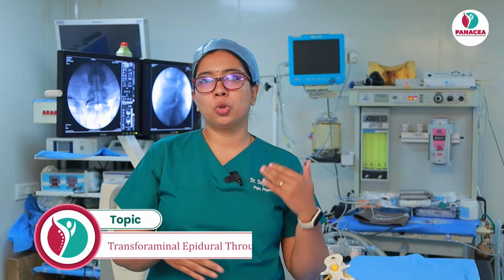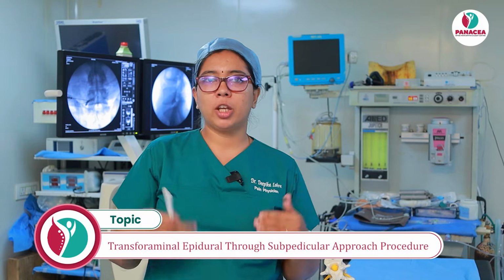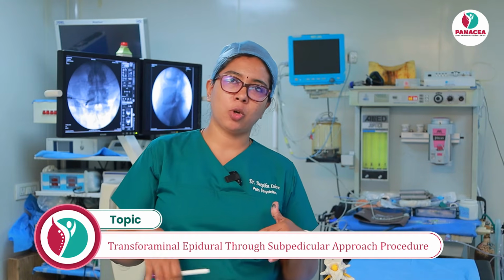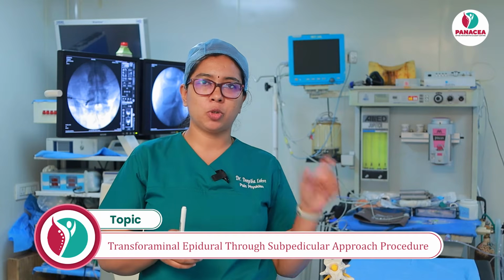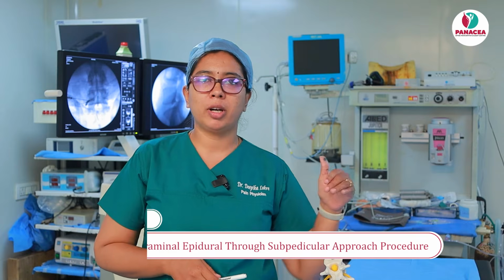So we have already seen the PNNP approach of the transforaminal epidural injection. Today we are going to talk about the subpedicular approach, or safe triangle approach, or supraneural approach. All these are the same kind of procedure, just different names. Safe triangle approach is just a nomenclature. It is not a safe kind of approach. It is just a misnomer.